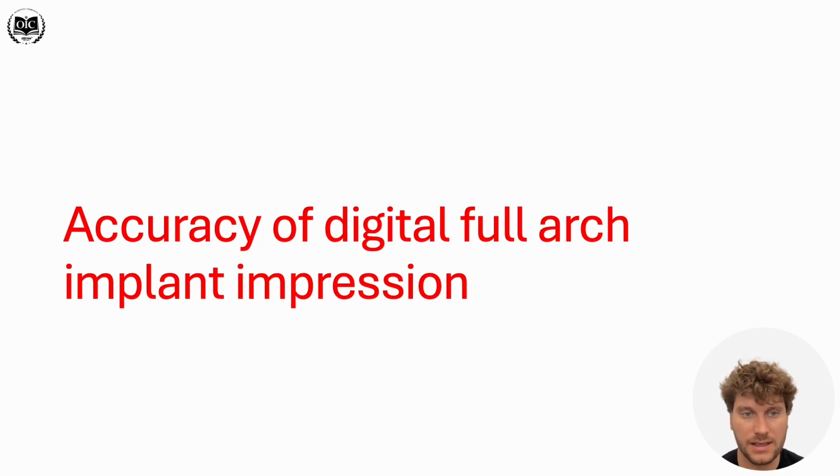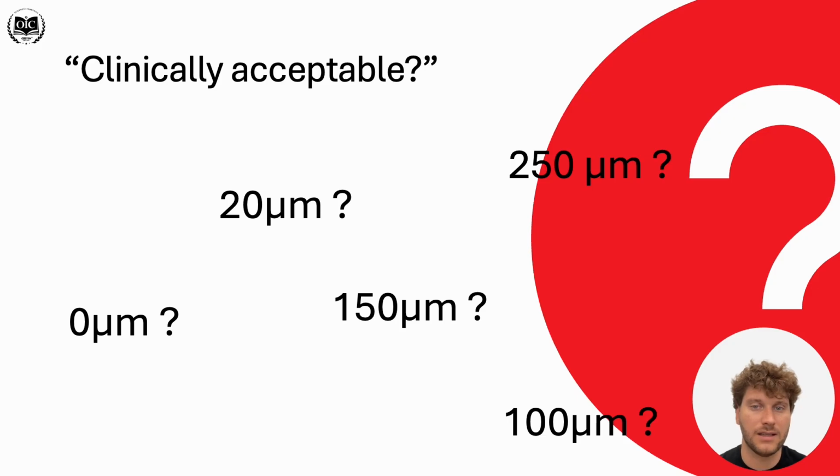So what is the accuracy of digital full arch implant cases? How can we say that this workflow is clinically acceptable? What deviations can we expect? 0 microns is probably the threshold that we all want, but realistically, we will not get there. And then there's a discussion about what is clinically acceptable: 20, 100, 150 microns. We'll talk through this.